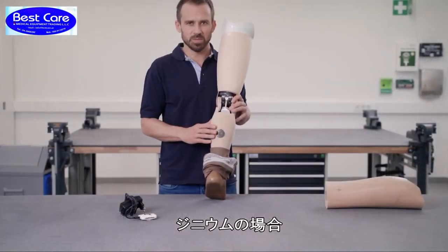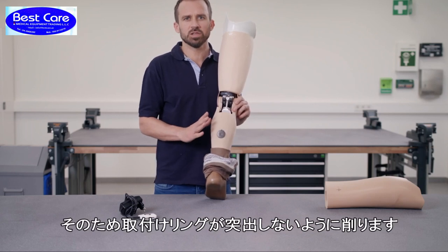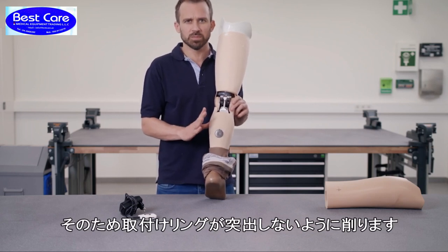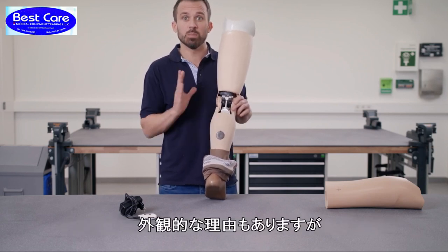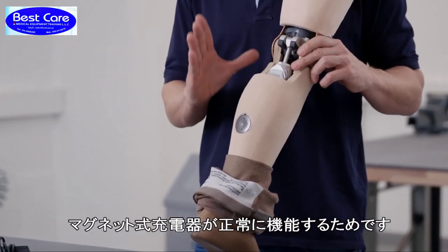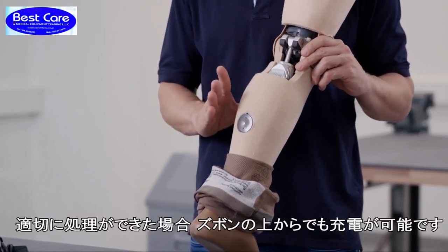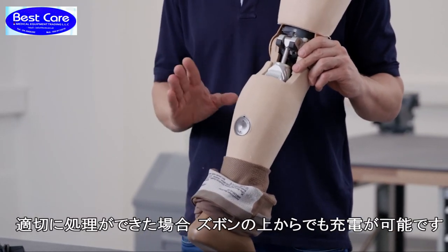A note on the Genium: the leg contour must, as you can see here, be completely flush with the inserted assembly ring — for optical reasons, but primarily so that inductive charging of the joint is possible and the charging unit doesn't get detached. If done properly, it works really well, with or without trousers.